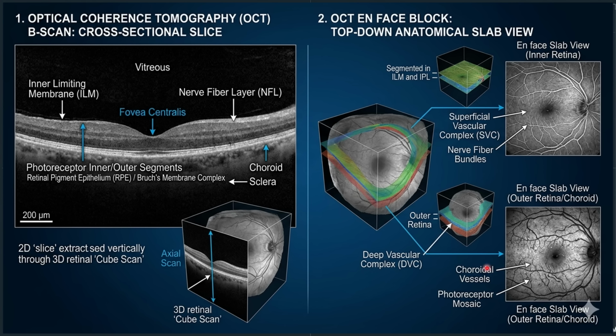Okay. So this is a very clear image. This is the best thing that we can gain from the OCT display, so you can have detailed information. As I said, the B scan gives you, for example, a pathology here, but you don't know the extent of this pathology within the retina. Is it just at this level, or is it beyond this one? That's why the three-dimensional en face slab is important for determining the pattern and the extension of the pathology inside the retina.